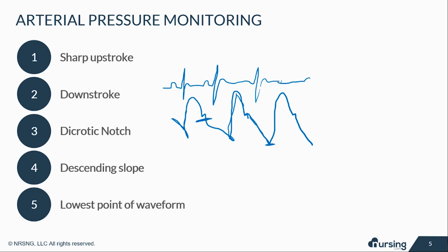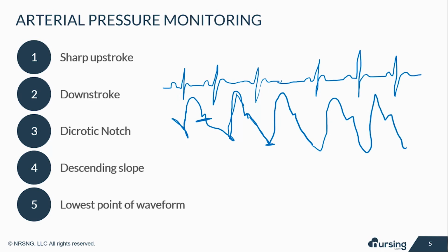So if this EKG were to keep going, here would come our waveform. I'm sorry, I'm not the best artist, but hopefully this gives you an idea of what to look for. So it's important as nurses that you always monitor the waveforms on your arterial monitor.